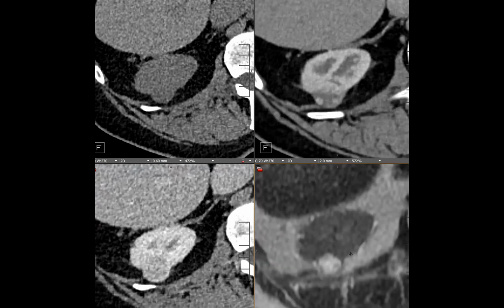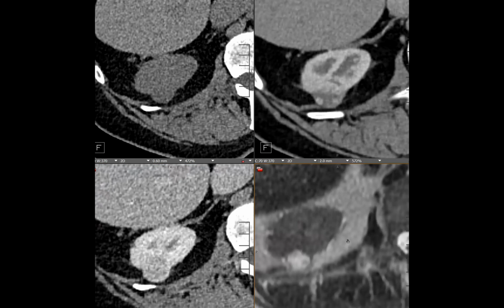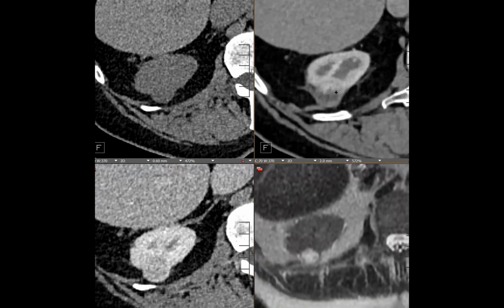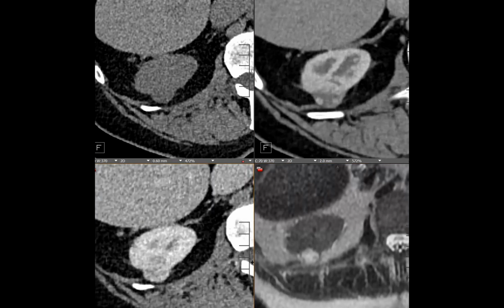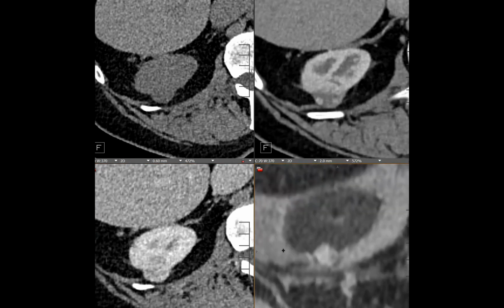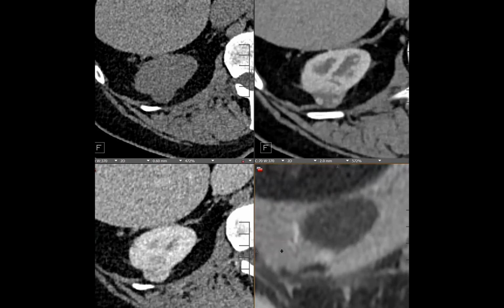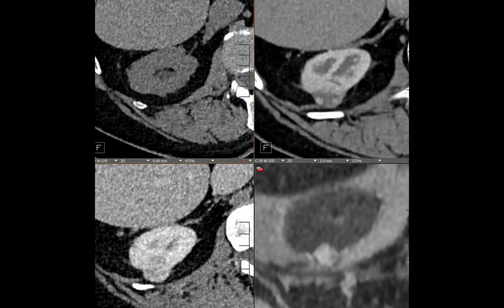And so this will be continually surveyed, but the T2 looks really bright to me. Is it not super bright for clear cell, or is that expected? And there's like this nodular enhancement that fills in, or do you guys feel pretty confident this is clear cell? I would like to see some vascular looking calcifications maybe on the non-con. Yeah, phleboliths. It doesn't have phleboliths, unfortunately, which would have helped so much.